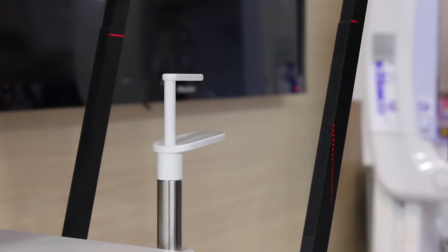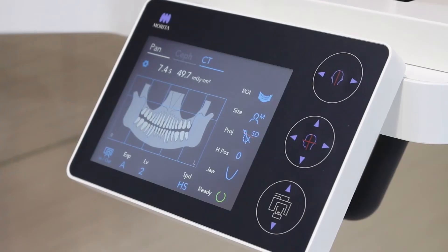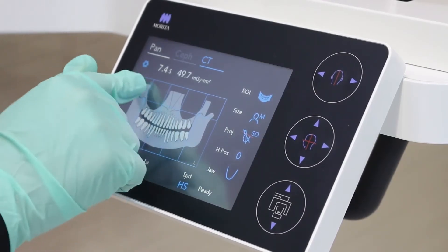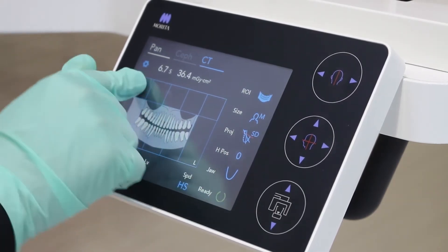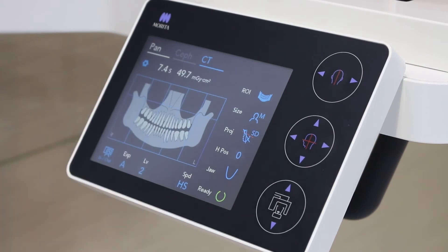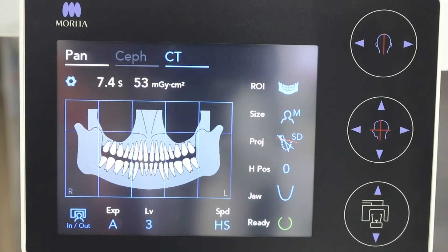Place a barrier sleeve over the bite stick of the panoramic chin rest. Select the panoramic regions to exclude certain areas if required — in this case we will acquire a standard panoramic. Then set your desired exposure level for the automatic exposure system.